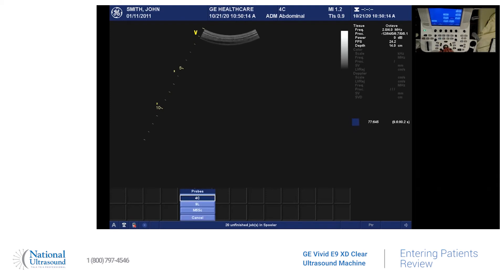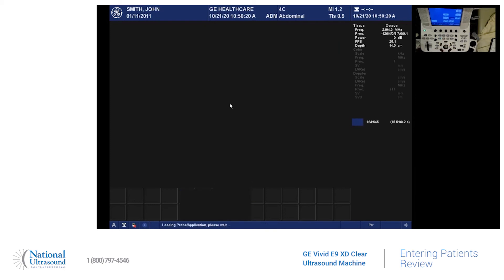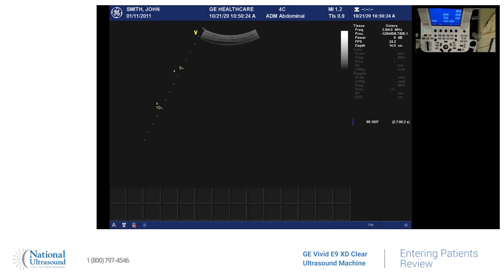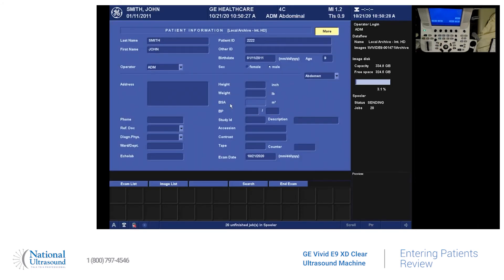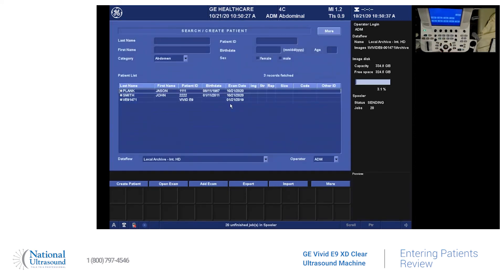So right now we'll stick with the 4C. And then you can pick your presets — abdominal renal — and go and stick with abdominal. And then you're ready to scan. Once you take your images, you're going to go back here to this patient button. And you can either again use the trackball or the touch screen, and then you can hit end exam. And they'll bring you back to your patient list.